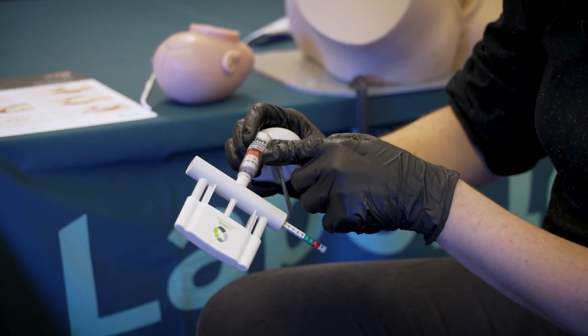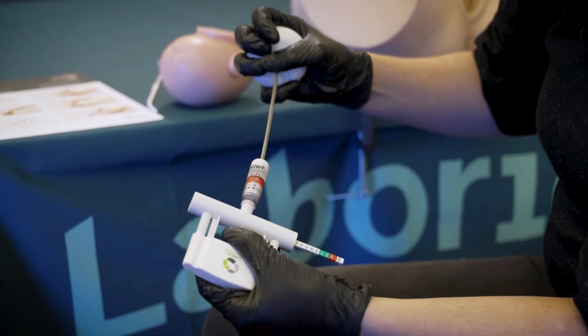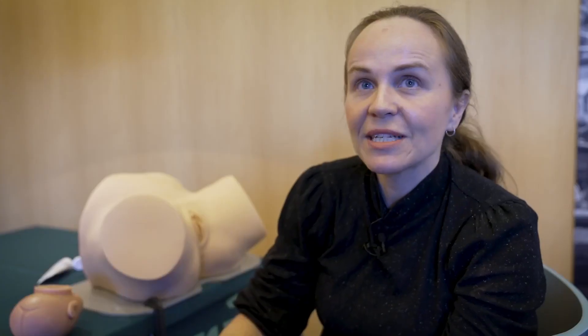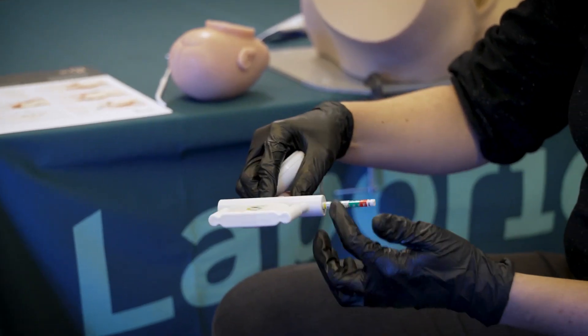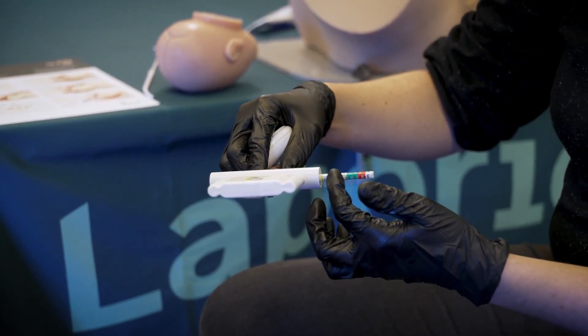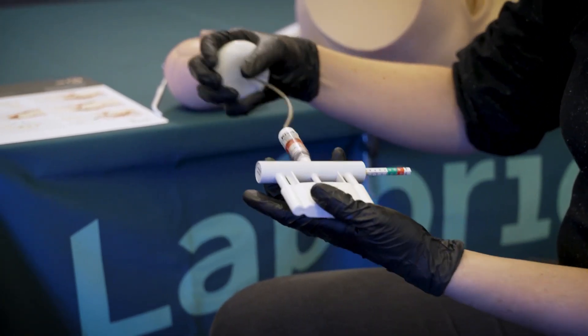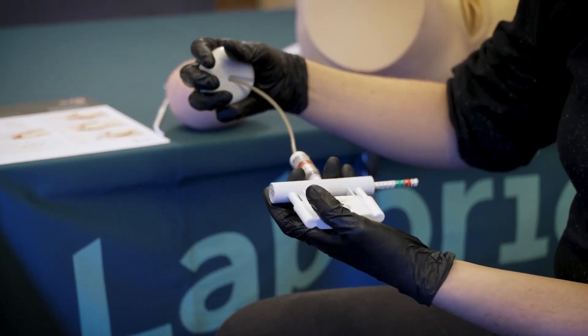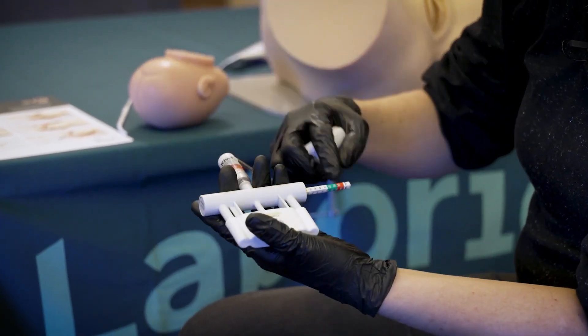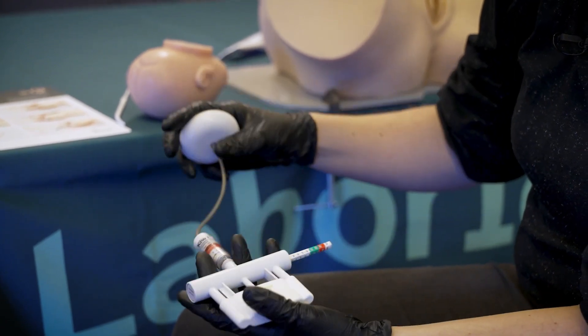When you're pulling, keep an eye on where your traction force indicator is. If you go into the red zone, think about whether there's anything about your technique you can modify to reduce the force. If you notice the vacuum suction is starting to release — you see the green or white zone — before you get a complete detachment, reinitiate the vacuum suction and only pull when you're right at the top of the green again.